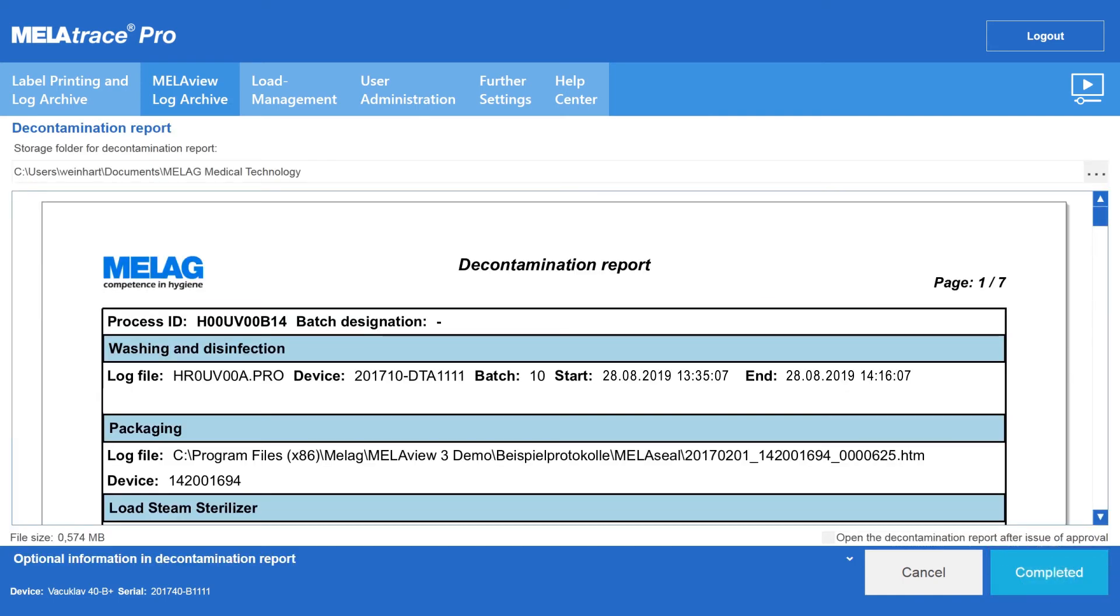The tamper-proof decontamination report summarises all the information relating to decontamination, as well as the text and graphic logs.